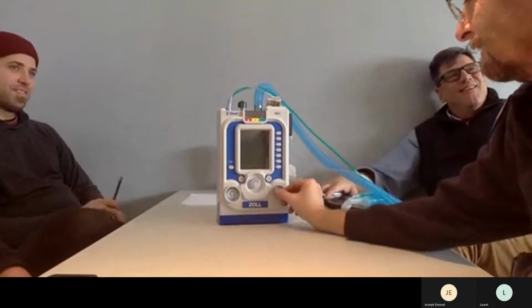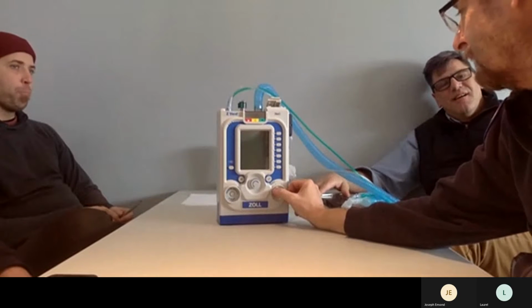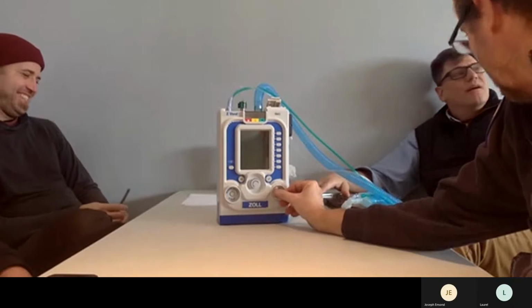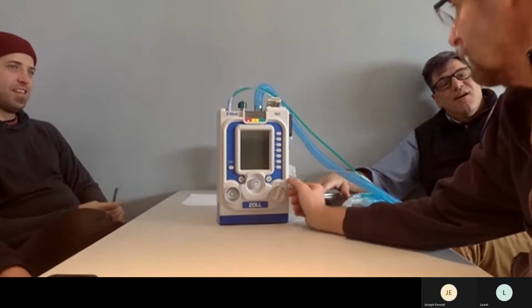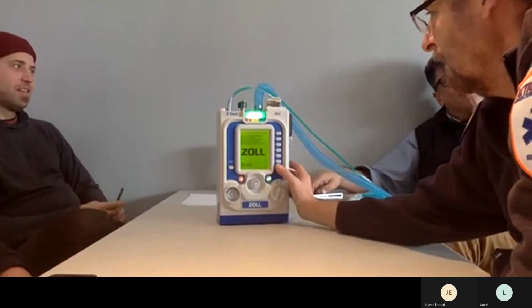Continuous plus. Sounds like BiPAP. Oh, now I'm going to use that. What is that word again, Mr. James? Big B, small i, PAP. I'm not allowed to use that word. Bi-level. BiPAP? Why? Because what do you guys call it? It's trademarked by Philips. Yeah. That's 100% dumb. So it should be BL, right? Yeah, bi-level.